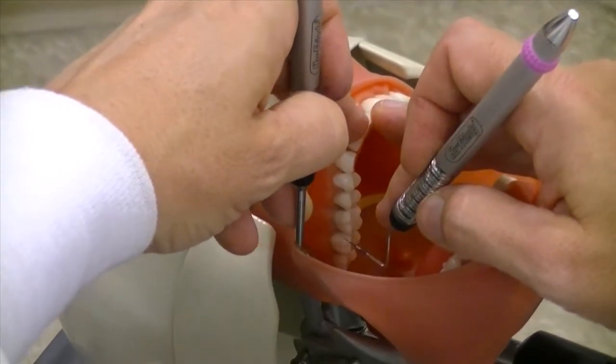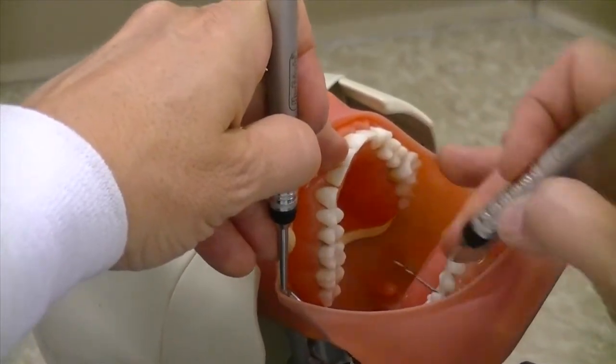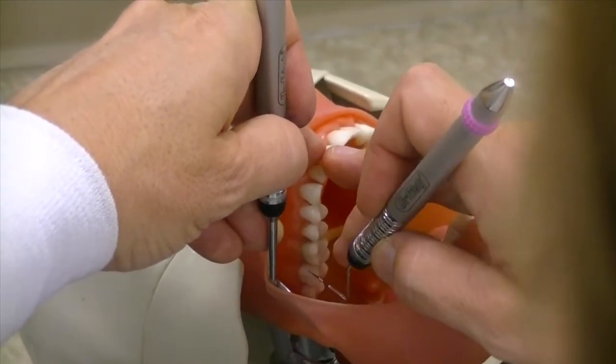You're retracting with the mirror, going in and retracting with the mirror, focusing on the facial of the anteriors with the instrument hand. You're focusing on the incisal edge of the anteriors.